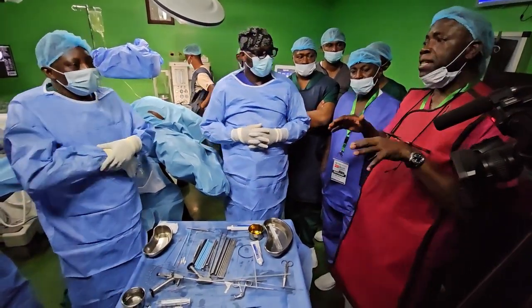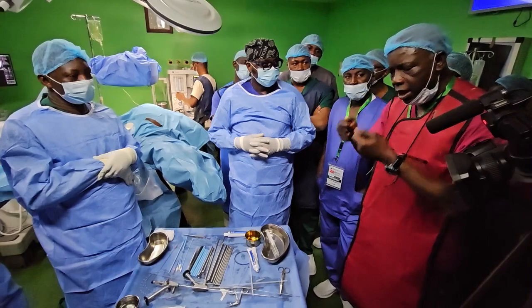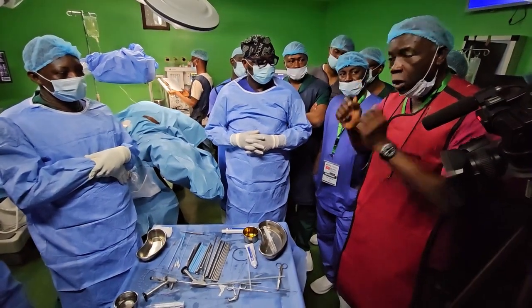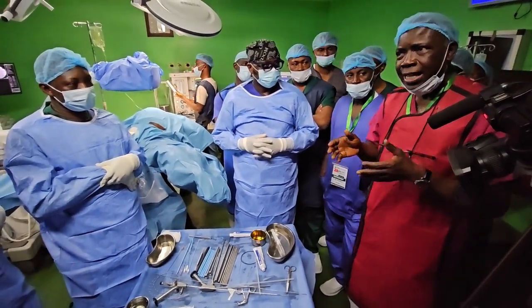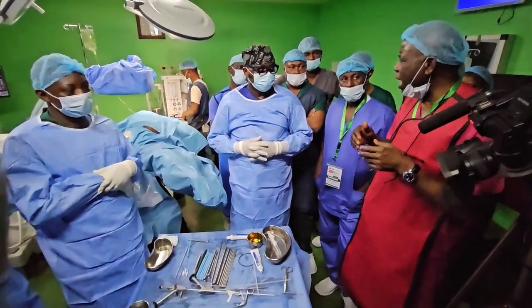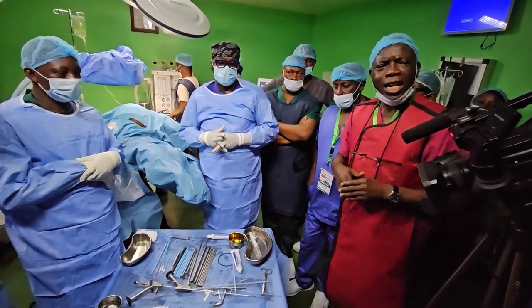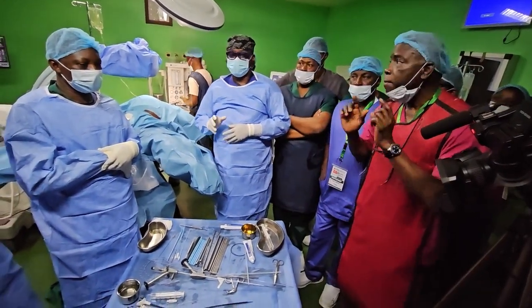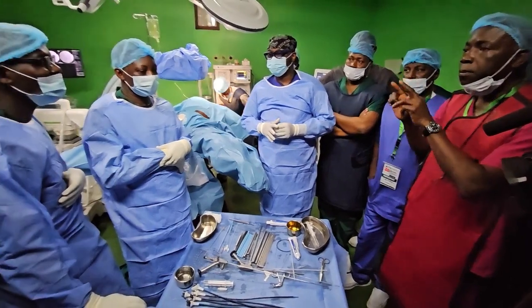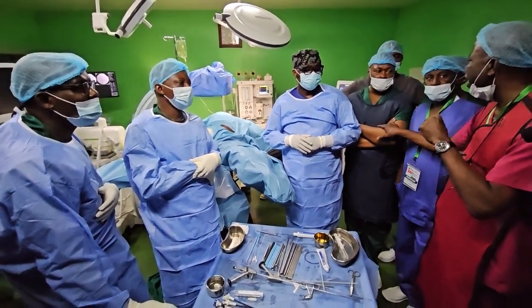So the reason I'm saying that, and I put it starkly, are you with me, is that it is not the only dilator you can use. There are alternatives. If you are very familiar with one, it's very good. I remember the one I was doing in Abuja, I think that was also what was used, and even the one done in Sokoto.